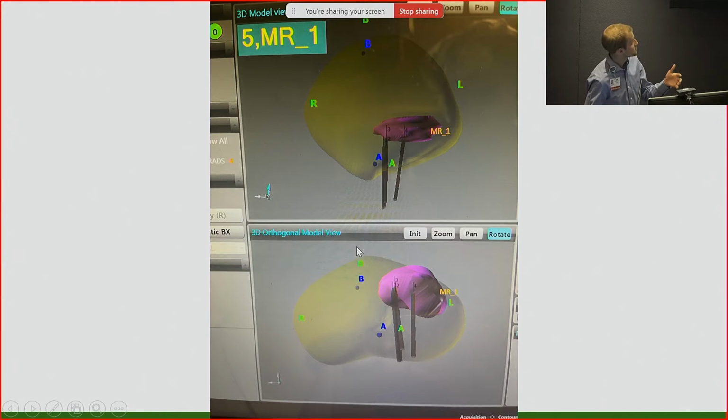So this is kind of looking at the prostate from above. This is looking at it sort of down the barrel of the gun. This is posterior. This is more anterior. Normal 12-core biopsy, you're going to just sample the peripheral zone back here, and you would never have probably stuck a needle into this unless you were really looking for it.